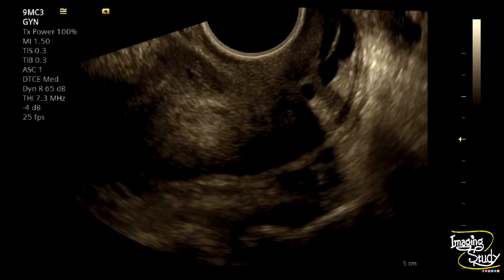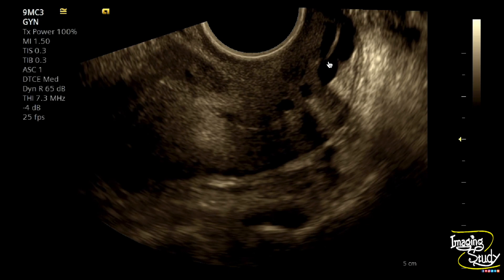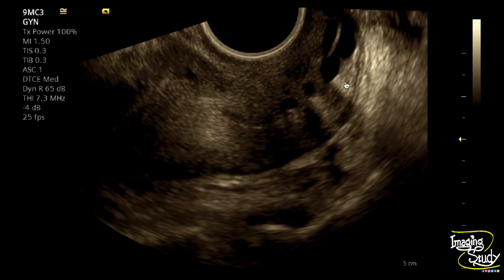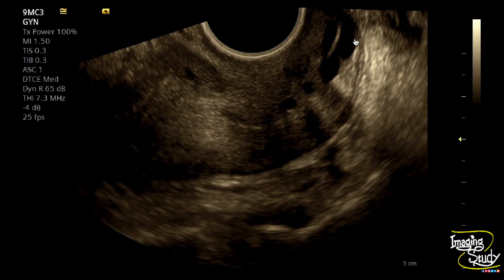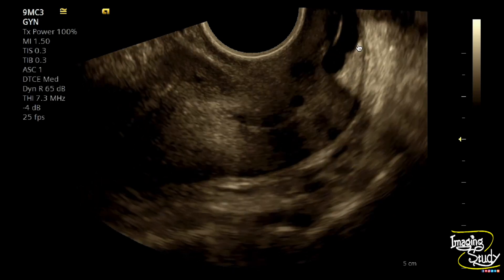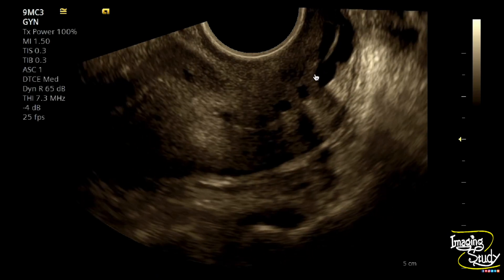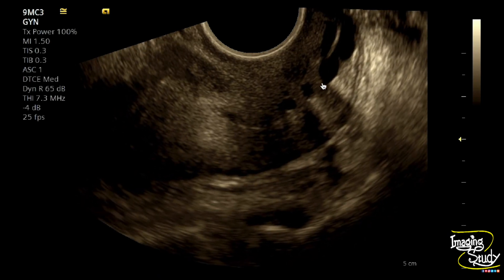Here is again the longitudinal section with focus towards the cervix, and you can see multiple well-defined anechoic cystic spaces having posterior acoustic enhancements at the cervical myometrium. These are the Nabothian cysts.